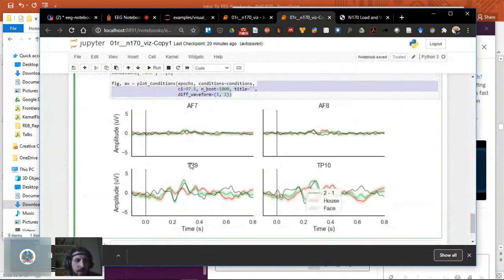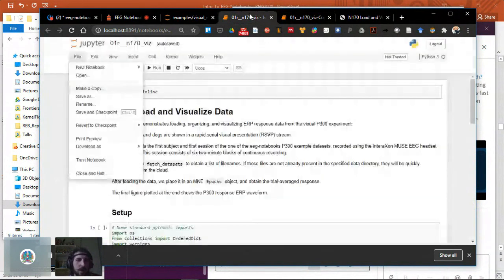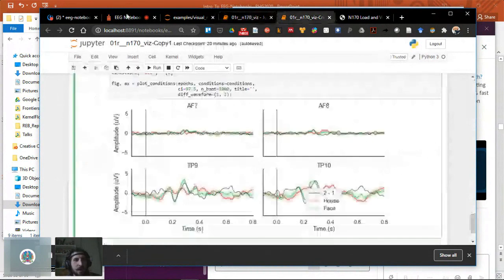Great, yeah. So that's it for the hands-on tutorial. Most of the second part of this you can just run through yourself. You just install the library, download this notebook, and then you'll be able to do everything I did for the last 5-10 minutes. The streaming component and the data collection component, obviously you need a device for, and we are here to help you with anything you want to do on both of those fronts. And I hope you enjoyed the talk.